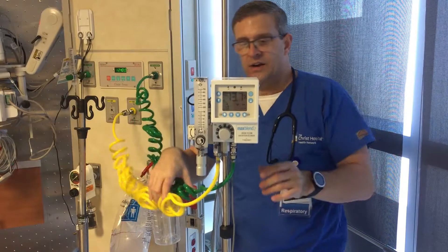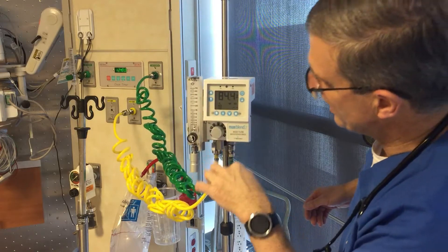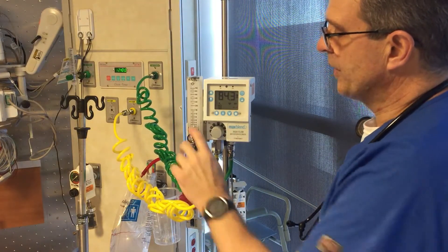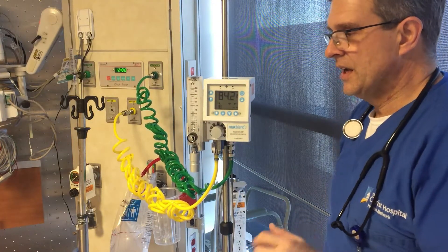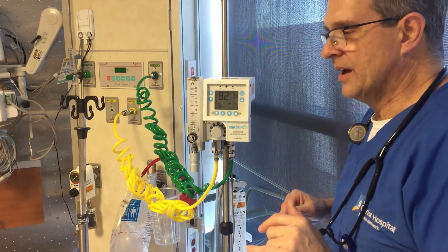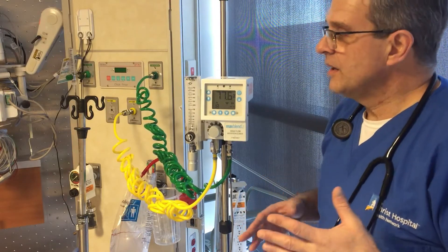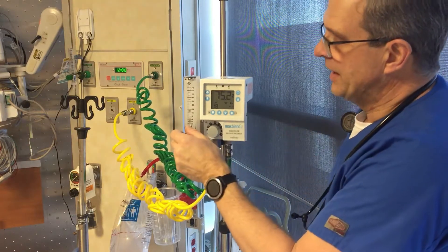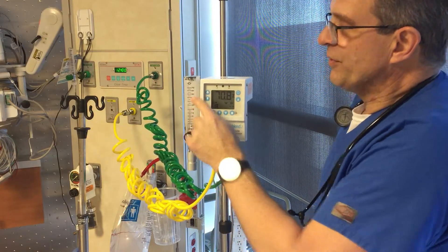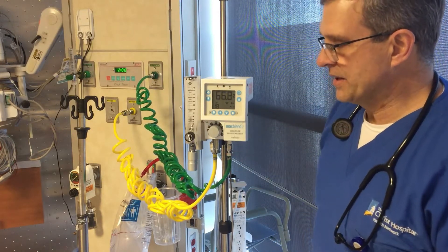The oxygen and air go into this blender so we can dial in a specific FiO2, from room air all the way up to 100%. So we have two settings on here: a flow setting and an FiO2 setting. The more flow, the more pressure gets built. If you've learned anything about CPAP, PEEP, or EPAP, this creates a baseline pressure. It's been said that for every 10 liters a minute of flow, the patient gets approximately one centimeter of water pressure of end expiratory pressure, or CPAP.